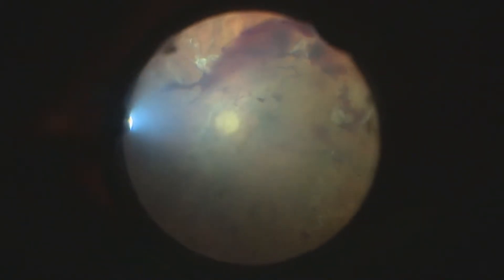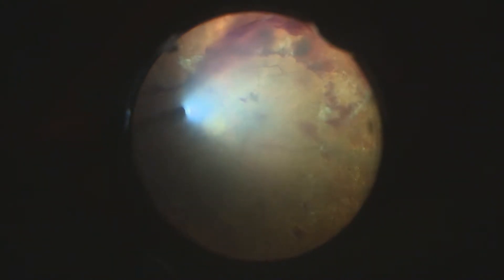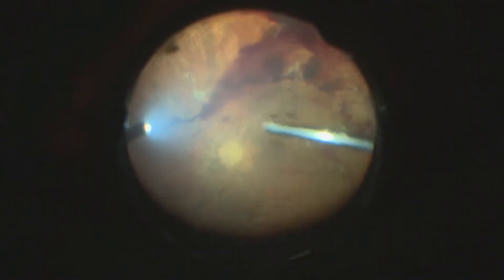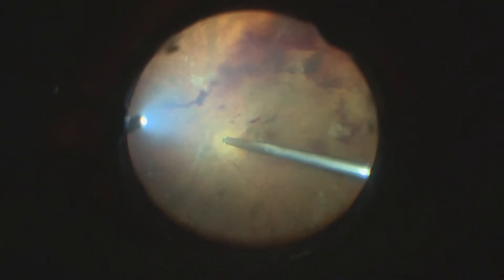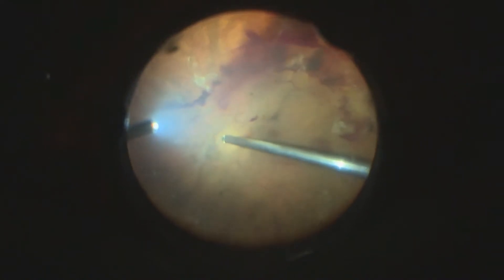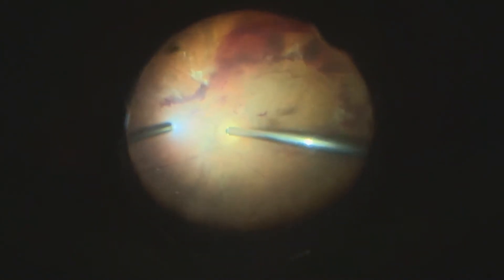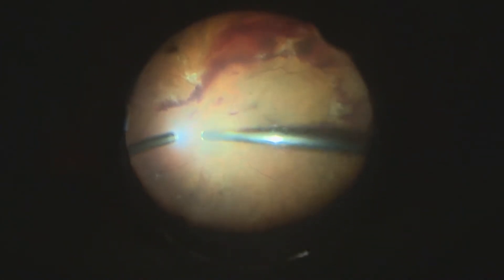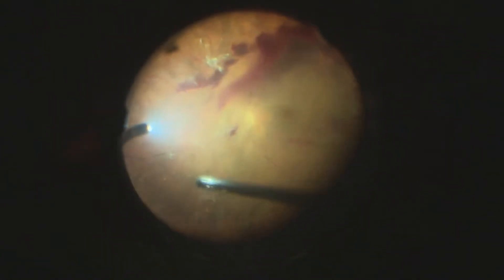The intention here is to show the difficulty of a surgeon doing a complex tractional retinal detachment. As you can observe, we are going to start trying to make a space and separating the posterior hyaloid from the retina, being careful with the epicenters that will be connected to the fibro-vascular tissue and retina.